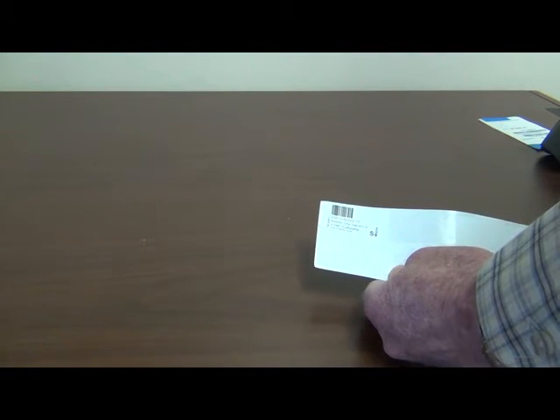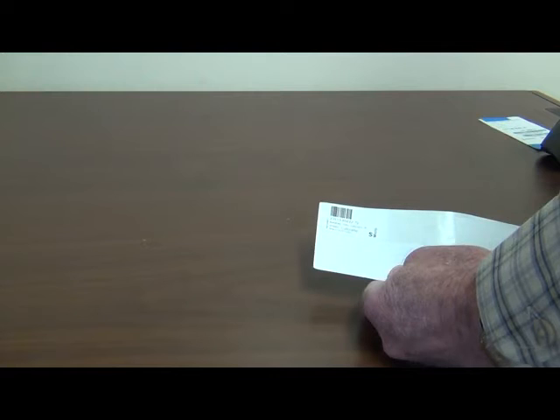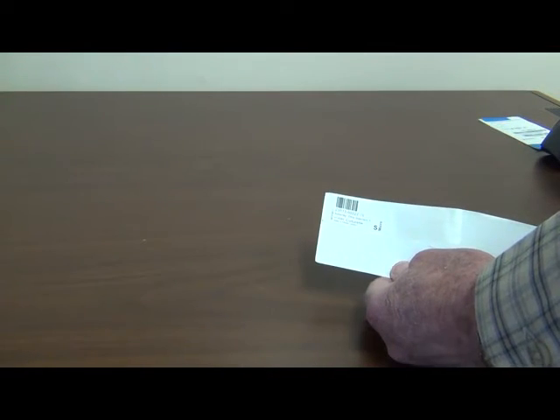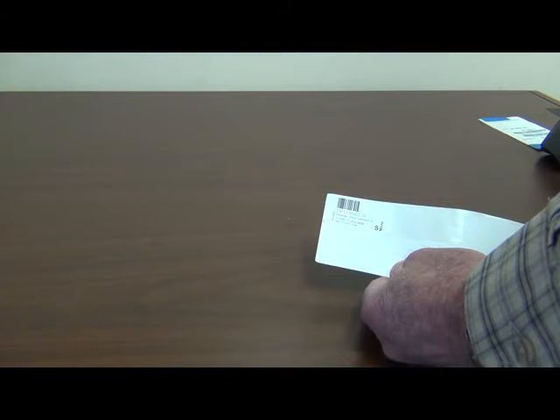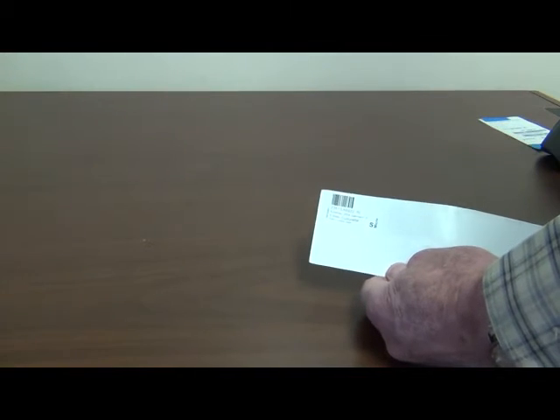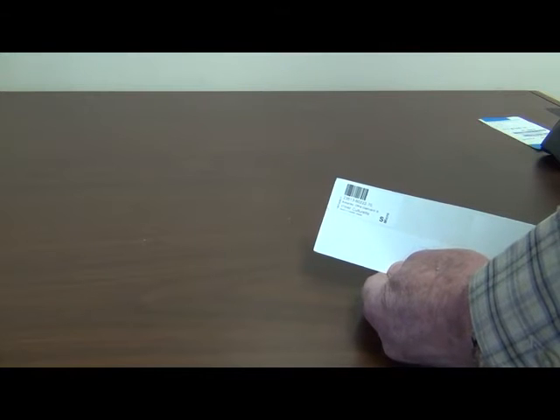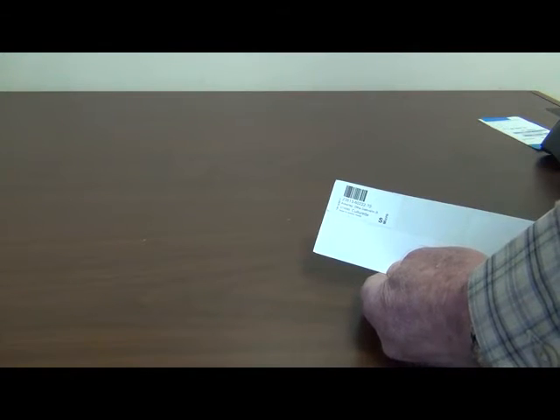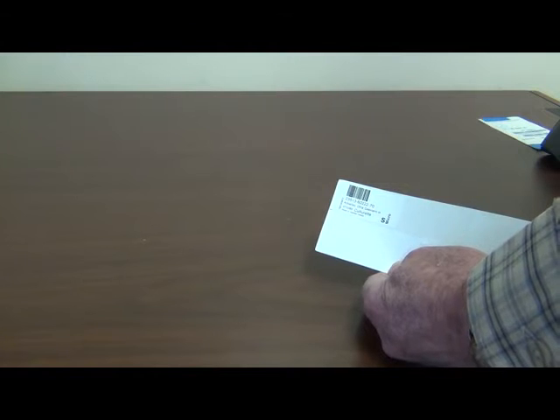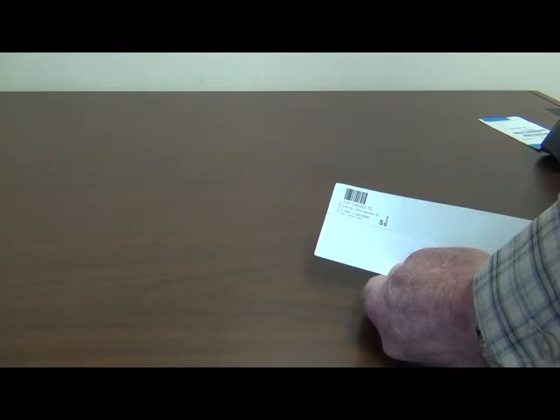Based on history, I can tell you that processes in manufacturers change, people come and go, and so you're probably going to be dealing with this type of issue continually over the future years. Getting feedback to the manufacturers now is important to establish the culture of what you actually need. And what you need is good, scannable, reliable, repeatable barcodes. You'll eventually probably develop a trust in some of your manufacturers that allows you to assume that they are producing good stuff.